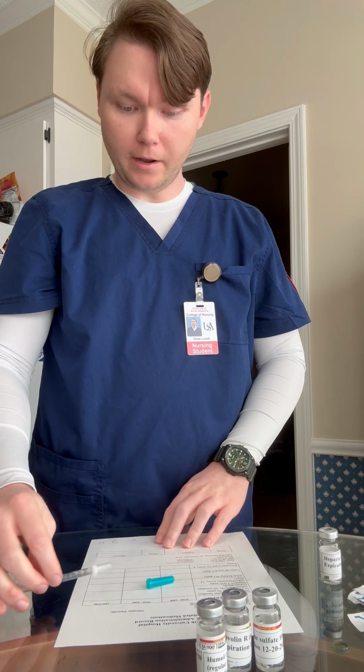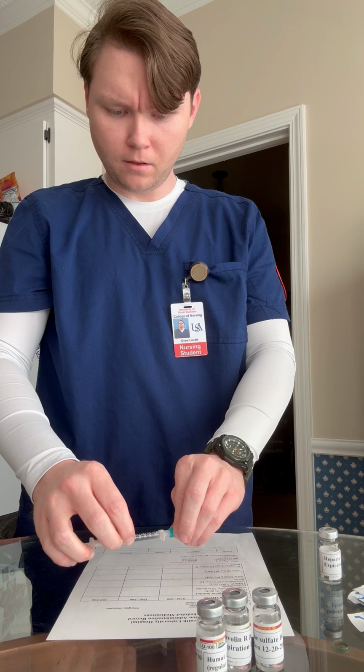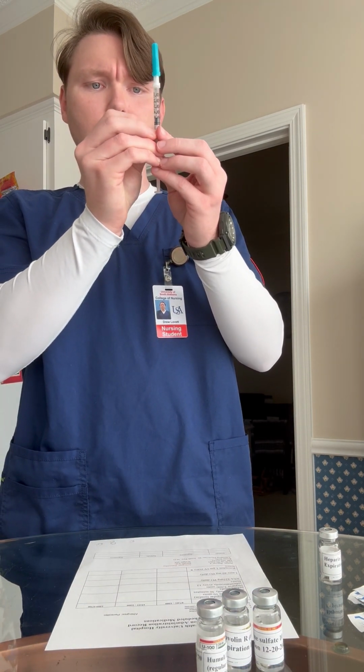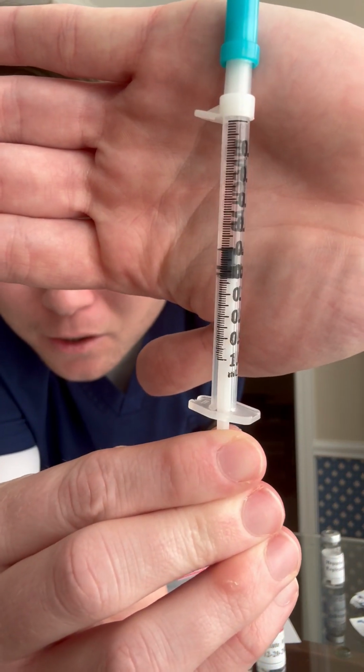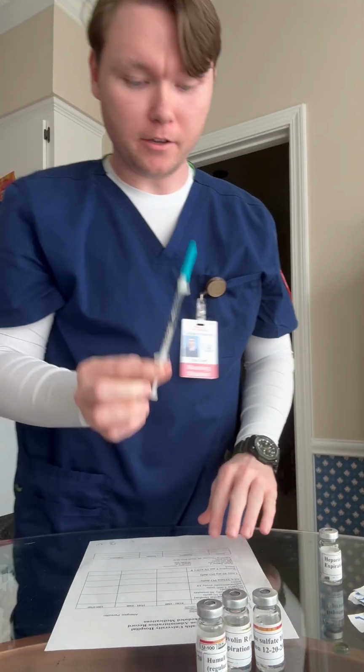All right, and since this is a clean needle, I'm going to slide it back into the cap. All right, so I have 0.5 of heparin, which is 5,000 units. So I have right patient, right medication, right route, subcutaneously, right dose, 0.5, which is 5,000 units, right time.